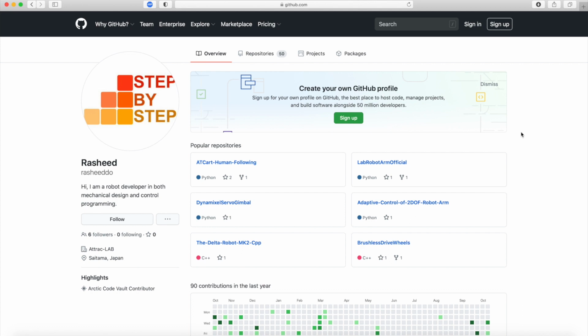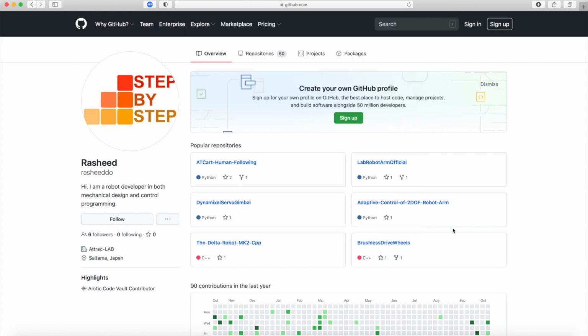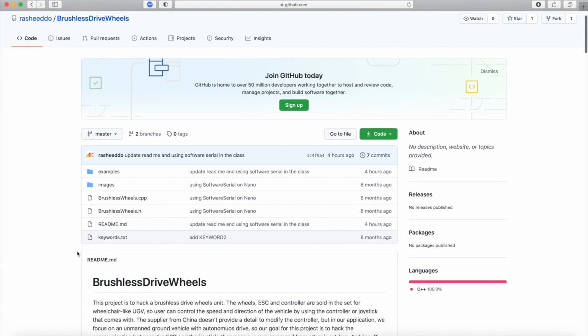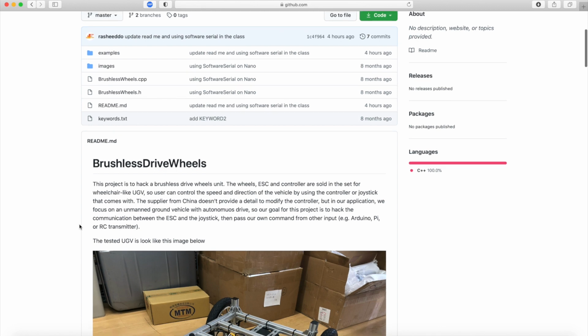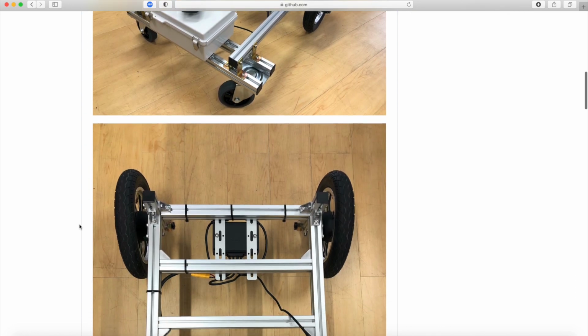Okay, so here we are. This is my GitHub repo. You can try searching for github.com/Rashido, and it will link you to this page. Here is the repo that we are focusing on, the brushless drive wheels. Just click on it, and you will see that I made documentation already. You can read through it, and I explain everything here.